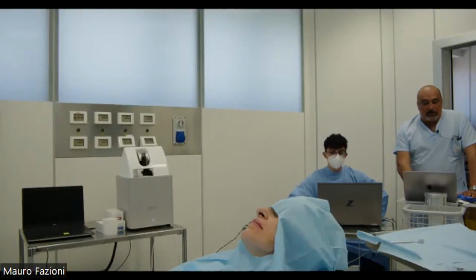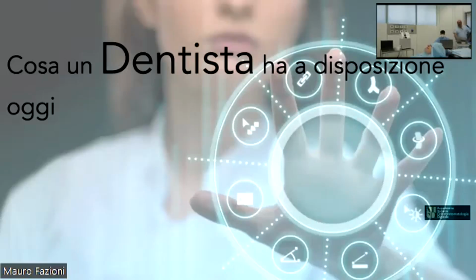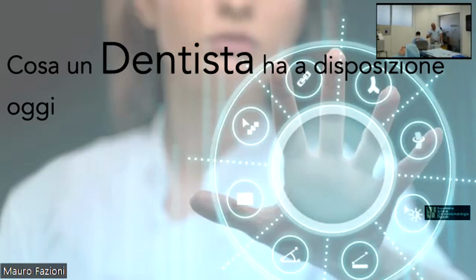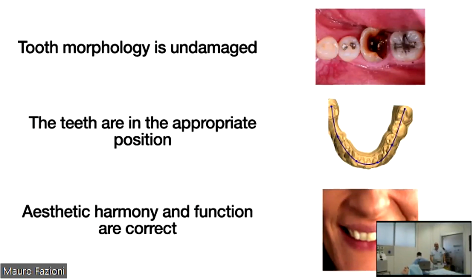What we want to start with is sharing with you our experience on the application of digital dentistry, from diagnosis to the final output, using in this case additive methods. Additive methods will change the possibilities of the dental practitioner, first of all in direct dentistry and direct restorative.